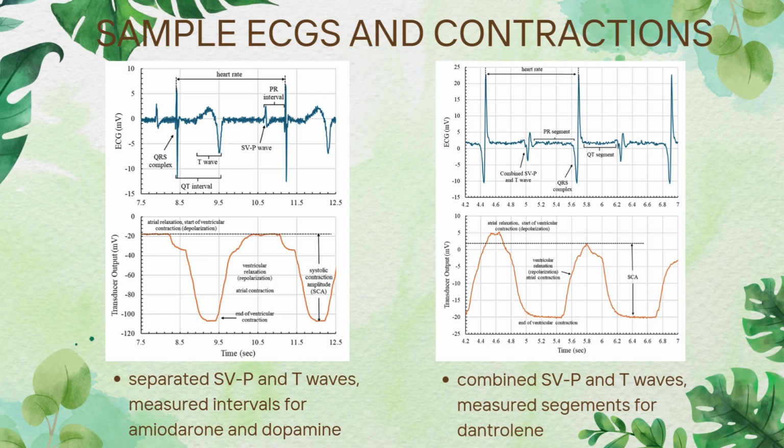Segments on the ECG measure the portion between two waves where no net electrical activity is occurring, whereas intervals on the ECG measure a particular wave and the length between them. Segments on the ECG measure the portion between the two waves.